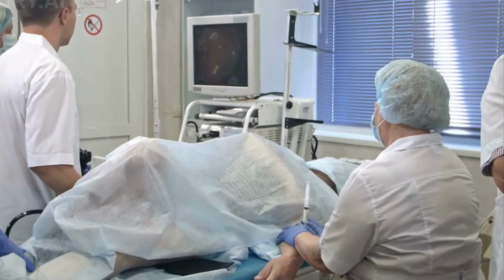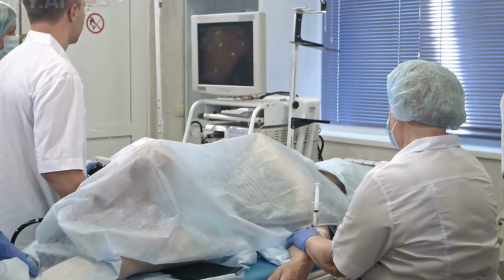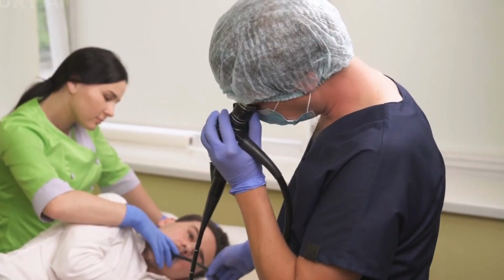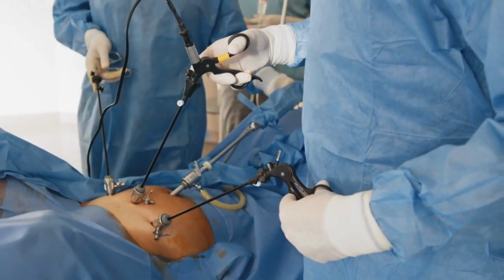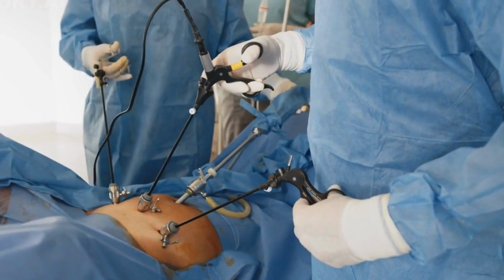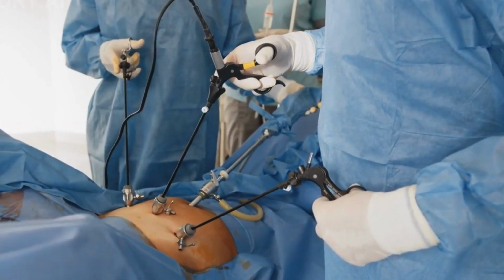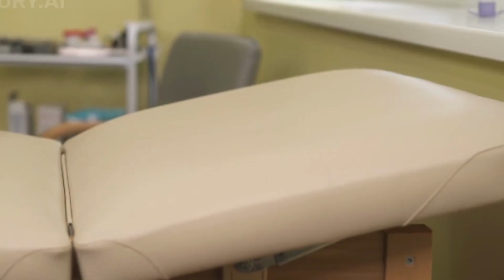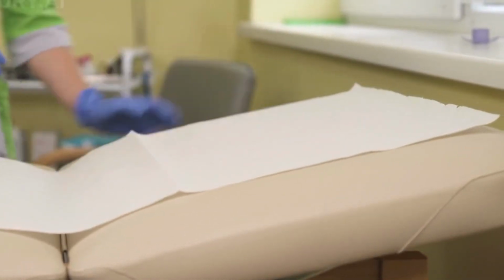There are various types of endoscopic procedures, each targeting specific organs or areas of the body. Some common types include: 1. Upper endoscopy, esophagogastroduodenoscopy. This procedure examines the esophagus, stomach, and duodenum, the upper part of the small intestine. It is used to diagnose conditions like GERD, ulcers, and tumors.